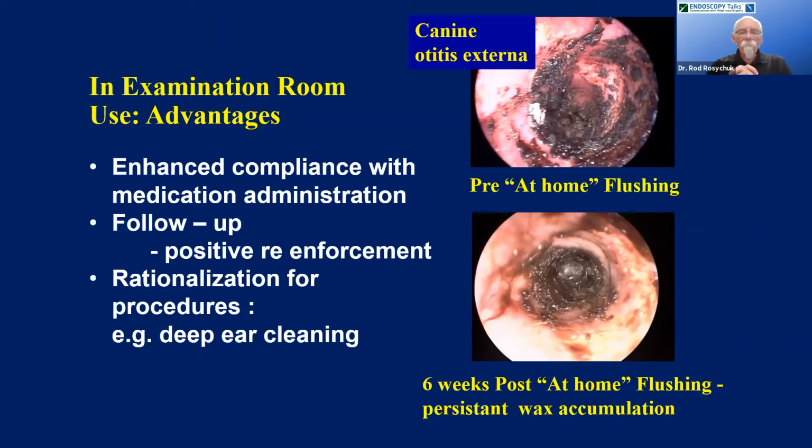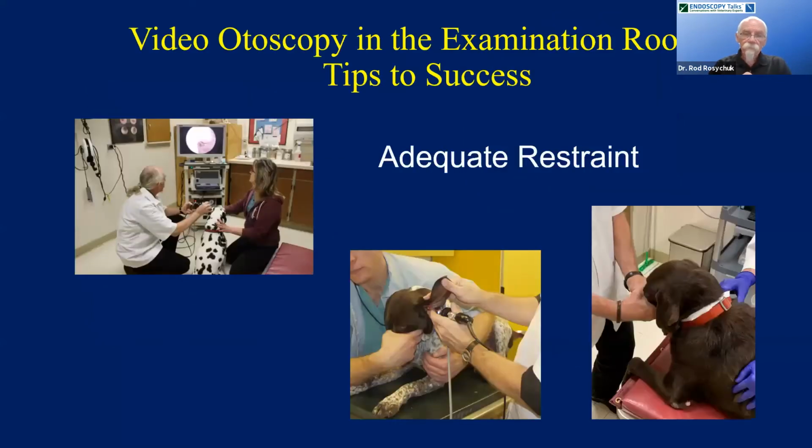So very positive reinforcement as far as what they've achieved, and sometimes the opposite, get an impression of what they haven't achieved. So for instance, a case like this, where they've already been flushing and treating this ear for several weeks, and we still have a significant amount of debris in the ear, it makes it very easy seeing this all pictorially to get people to buy into, for instance, deep ear cleaning.